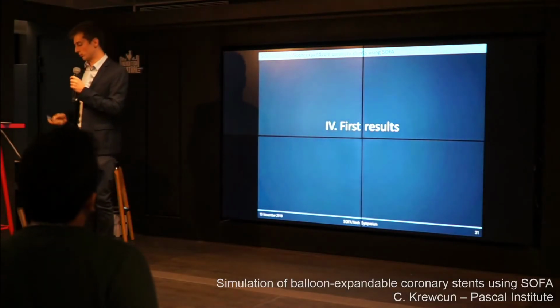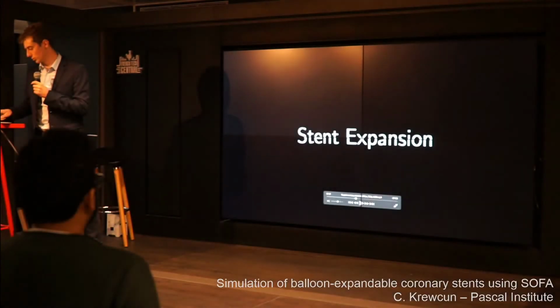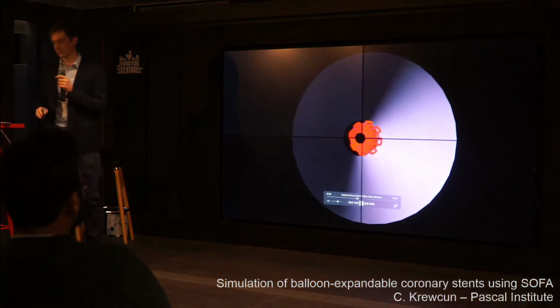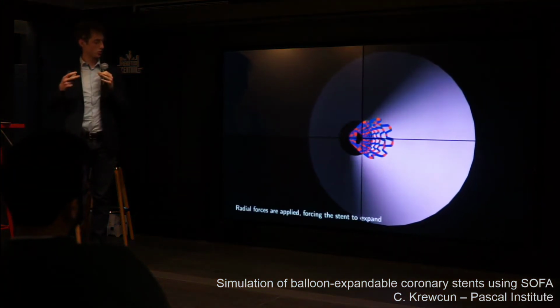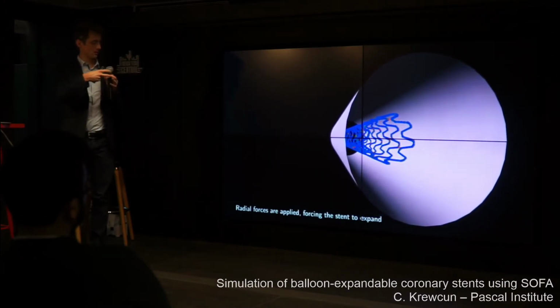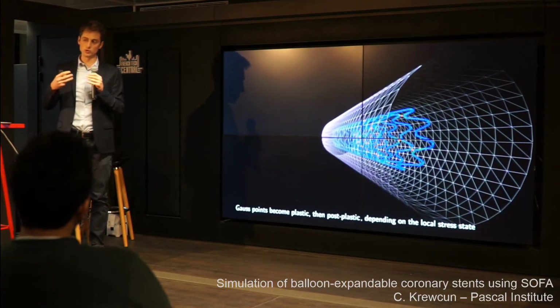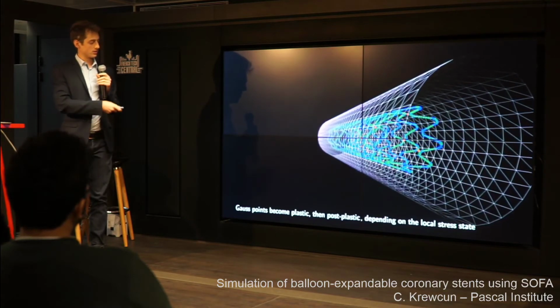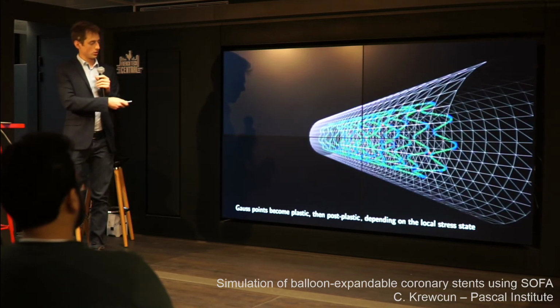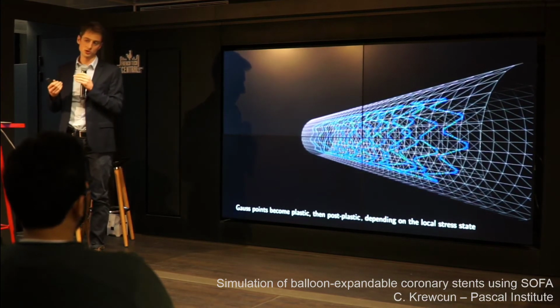Now I'm going to briefly show you a few results. First, I'll show you a brief insight of what the simulation looked like. This is a very simple example with a straight cylindrical artery, and you can see that the stent inside is expanding. The balloon is not modeled directly here. We use very stiff springs to mimic the action of the balloon. Under the action of the springs, the stent is progressively expanded, with a change of color, which corresponds to the switch from an elastic deformation to a plastic deformation.